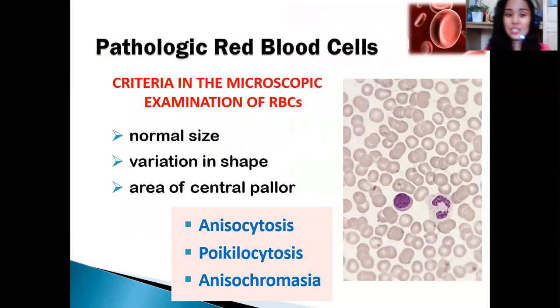So we're finished with the normal red blood cells. Now, we're heading on to your pathologic red blood cells.